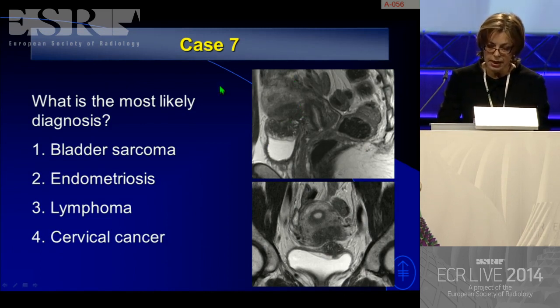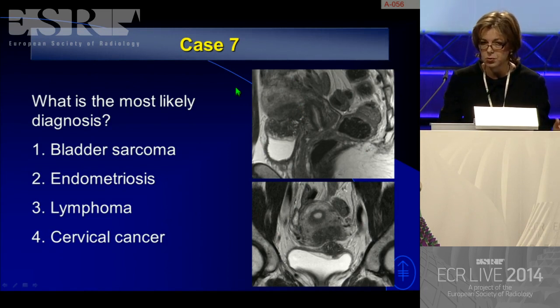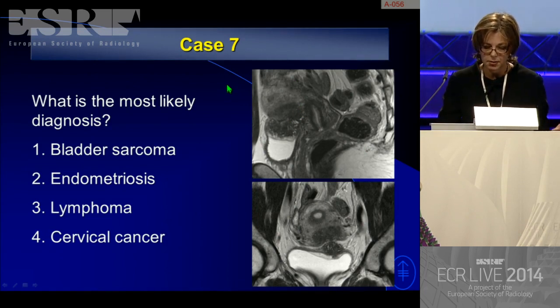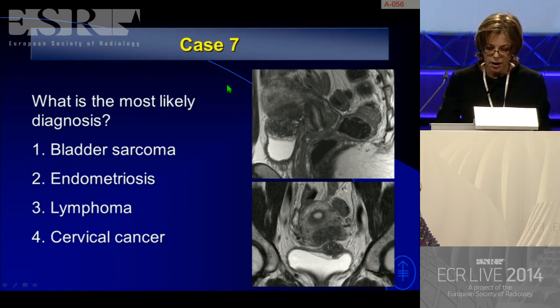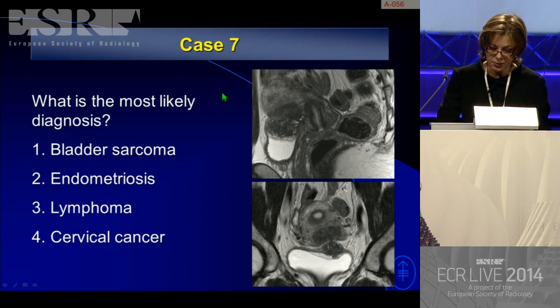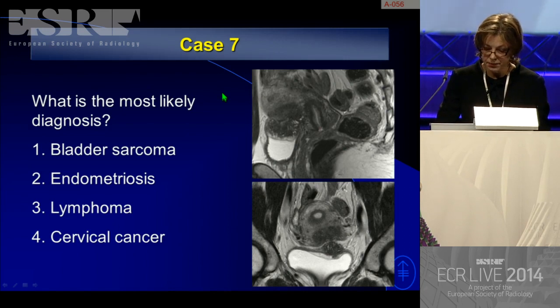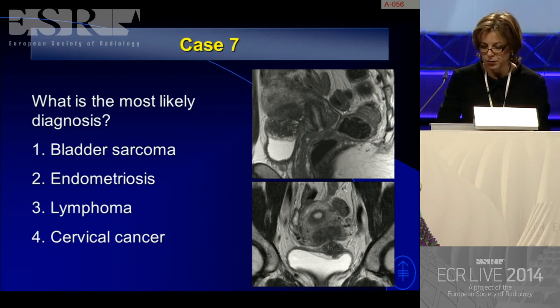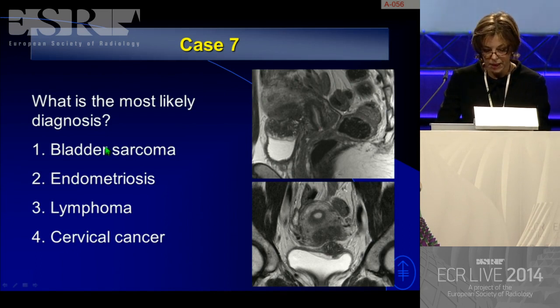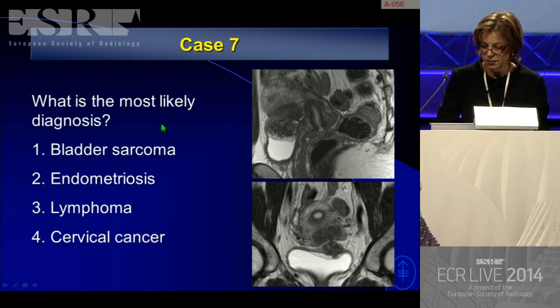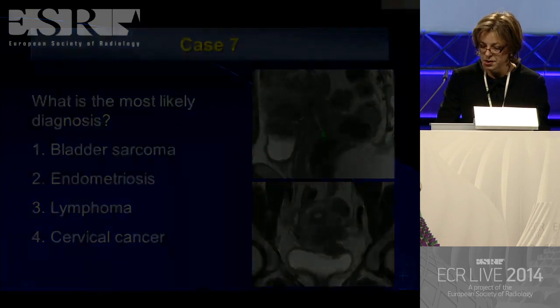The choices for diagnosis are: bladder sarcoma as the pathologist suggested, severe endometriosis, lymphoma, or cervical cancer. Note the relationship of the lesion to the cervix and lower uterine segment.